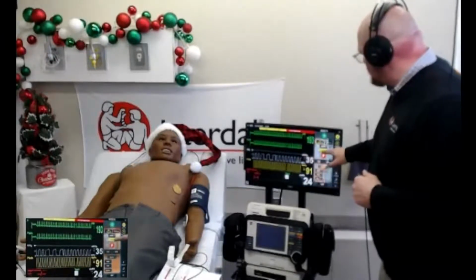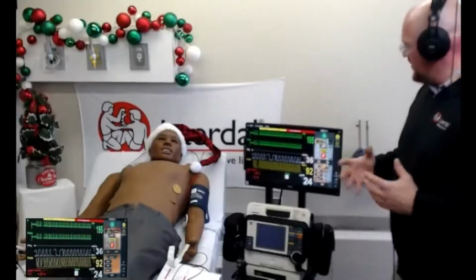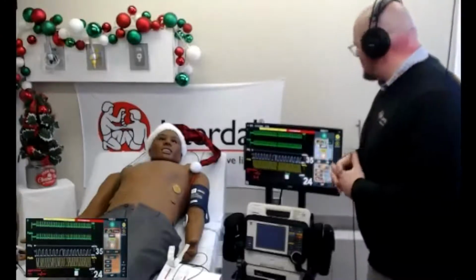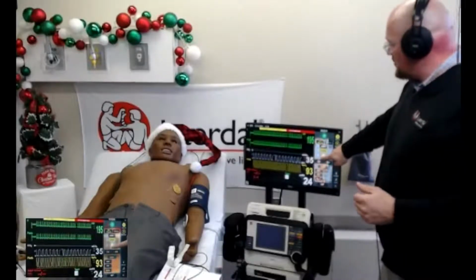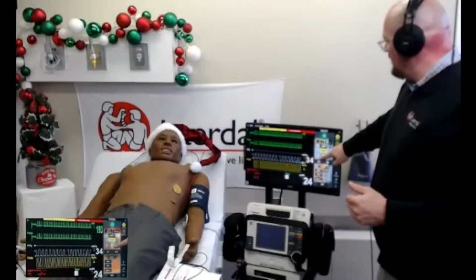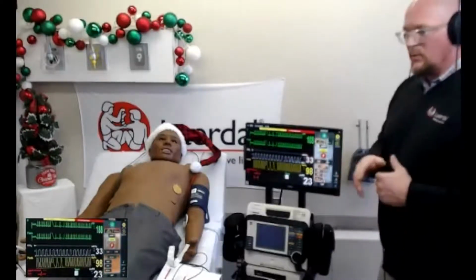There we go, 100 joules. We'll hit charge. There's that same delay, that same sound that we're looking for. All right, so this is a synchronized cardioversion, so I'm going to have to actually press and hold, just like a real one. Nope. There we go, delivered, and now we've gone back into normal.